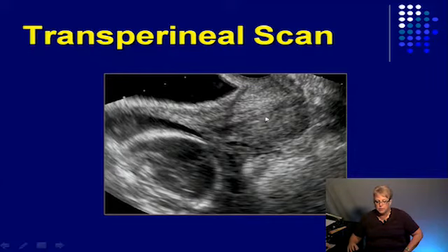So we're just coming here and we're looking. It takes a while to get used to scanning that way, but you get a fairly close image to what you get with a transvag.